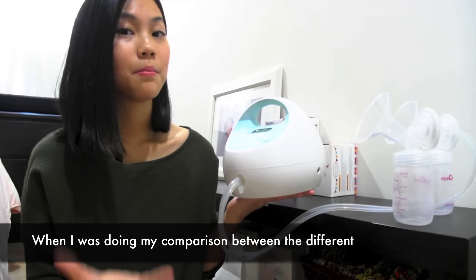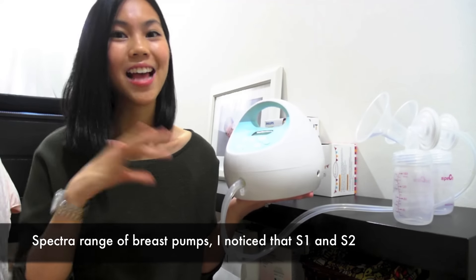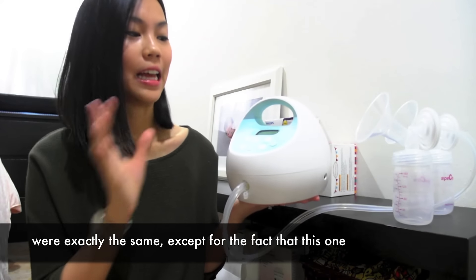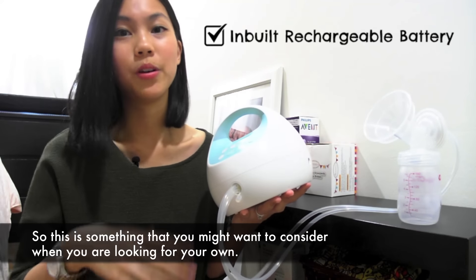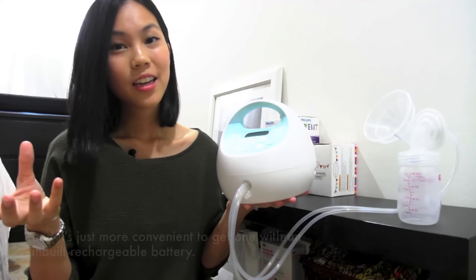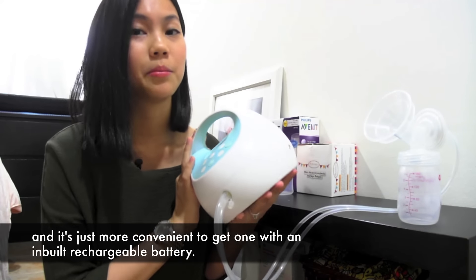When I was doing my comparison between the different Spectra range of breast pumps, I noticed that the S1 and S2 were exactly the same except for the fact that the S1 comes with an inbuilt rechargeable battery. So this is something you might want to consider when you're looking for your own, because it's just more convenient to get one with an inbuilt rechargeable battery.